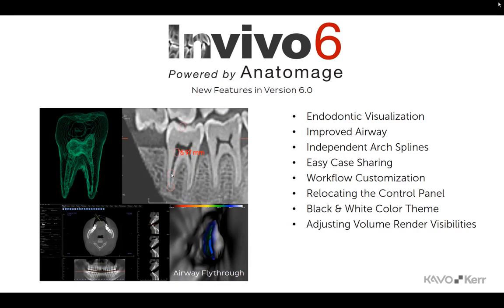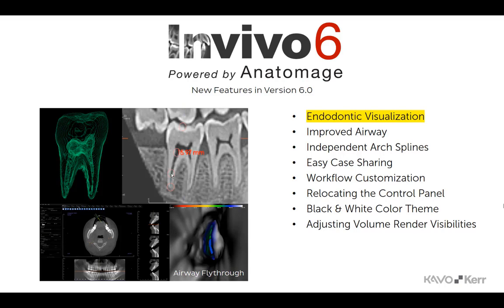A new endo view has been added to Invivo, offering a more complete examination of both internal and external tooth structures. Clinicians can more easily visualize internal canal morphology, including root curvature, number, and location of canals.